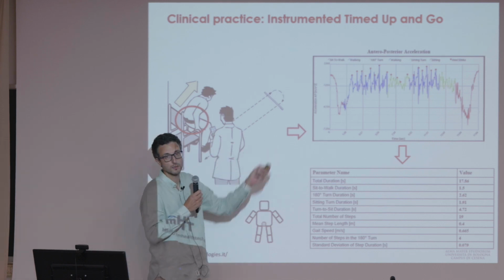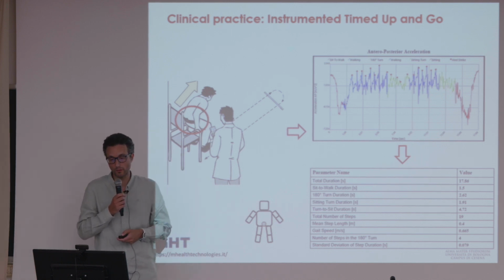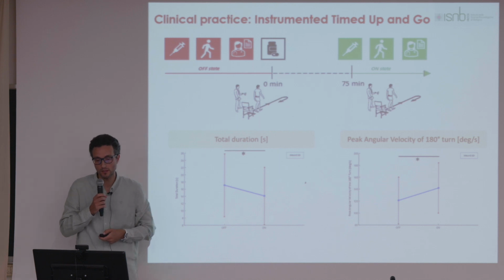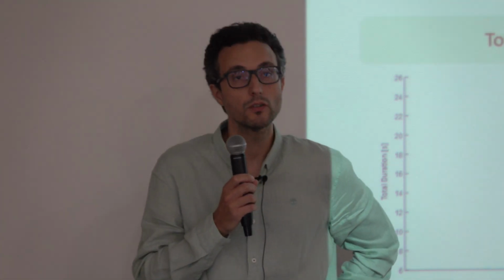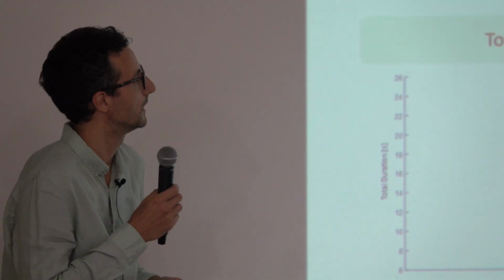So the idea is to instead record the signal during this test, so that, for example, we are able to segment the test into its different parts in order to get information on the functional performance in those different parts. This, for example, allows us to understand and evaluate what is the impact on mobility of the medication. You can see here on the left, people who were tested without medication, and on the right, people that were tested after the medication started its effect. So we can see the total duration, for example, taken automatically by this test, where the patient just has to wear a single sensor on the lower back, and the clinician must start a mobile app like we saw in the wearable session.